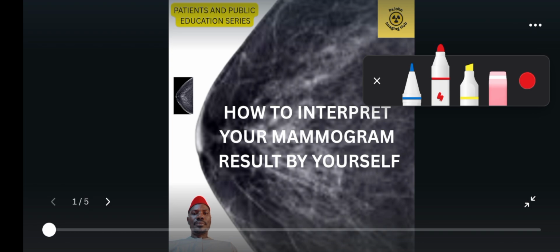In today's patient and public education series, we'll look at how you can interpret your mammogram result by yourself.